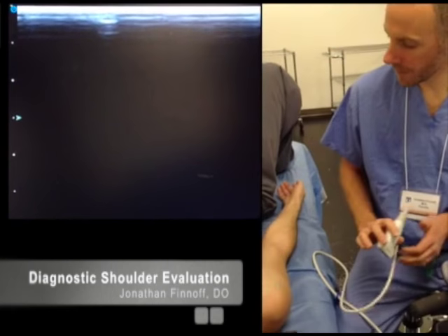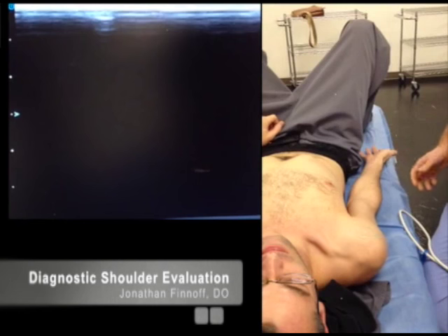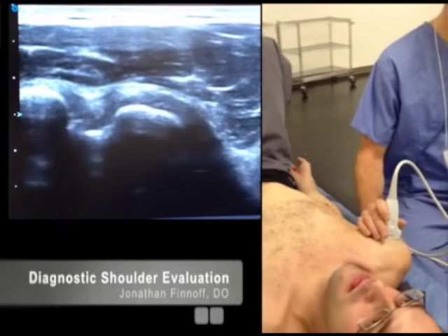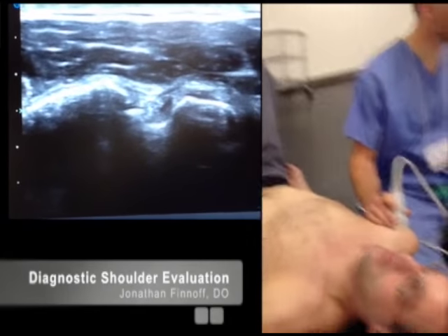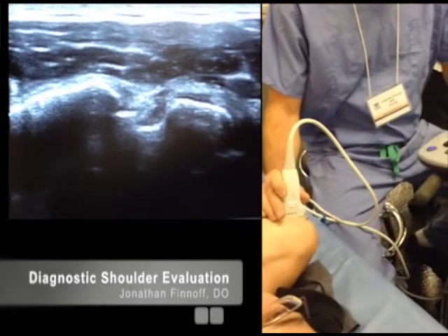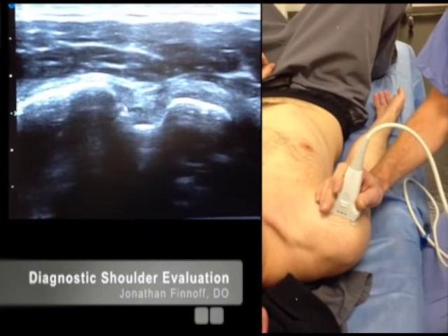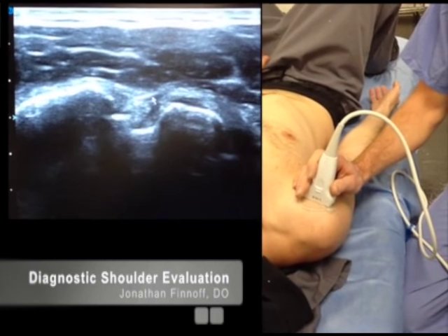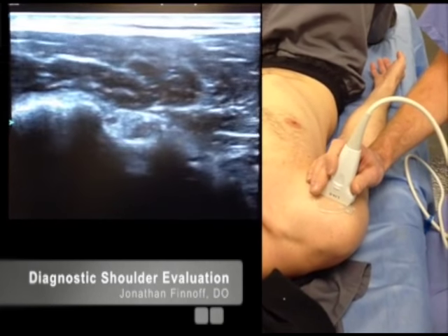The first structure we're going to look at is the biceps tendon. I have the patient with their arm at their side and their palm up in a supinated position. On the screen, medial is on the right, lateral is on the left. The intertubercular groove is in the middle of the screen with the biceps tendon right there. Sitting over the top of the biceps tendon is the transverse humeral ligament, which holds the biceps tendon in the groove.